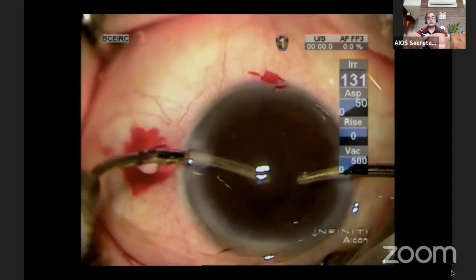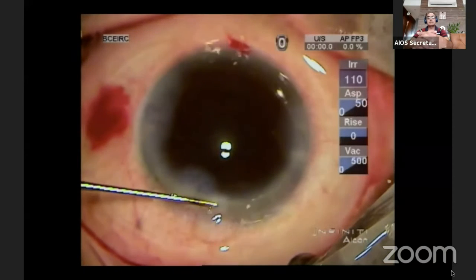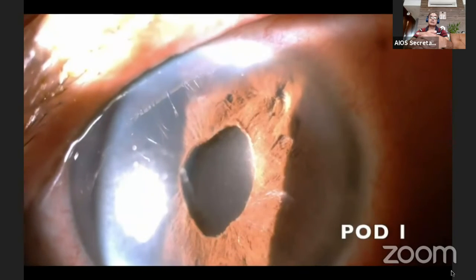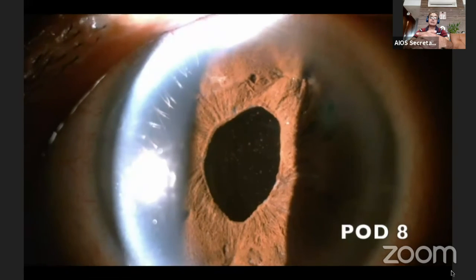At the end, the OVD is washed and vitrectomy is done if required. Thus, using only 2 or 3 side ports, the entire IOL is secured to the back of the iris using this Sipser's knot technique.